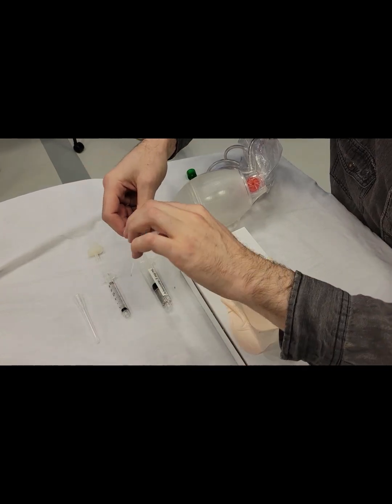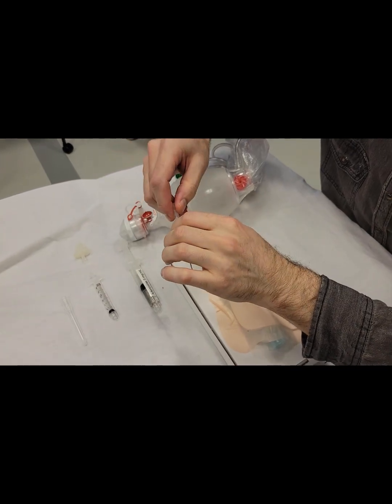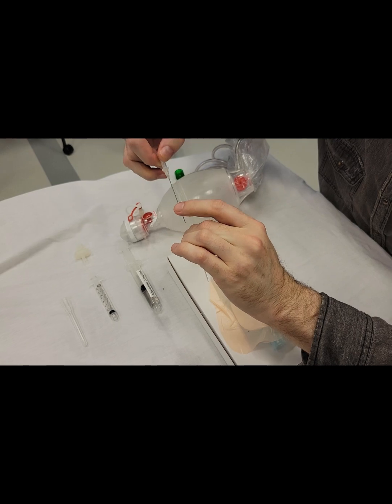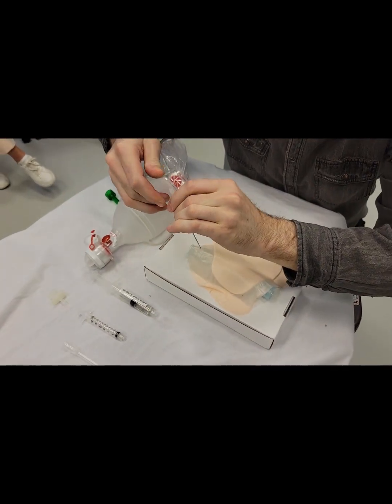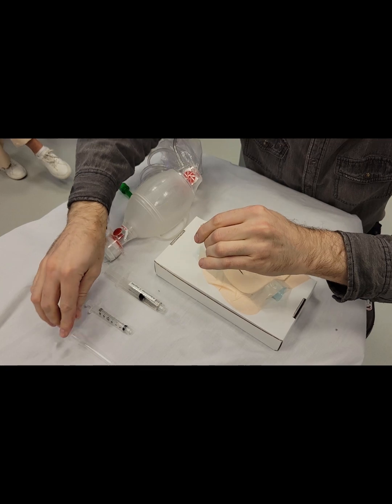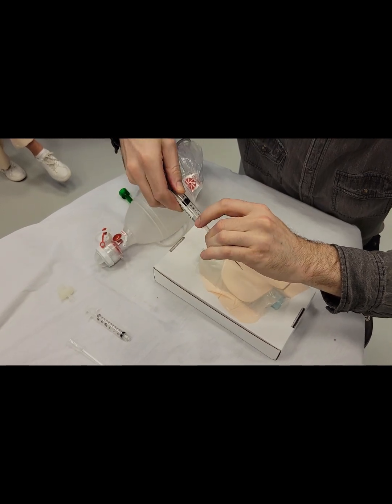So first thing you're going to do is you're going to get your angiocath ready, and then you're going to have the syringe hooked up here.